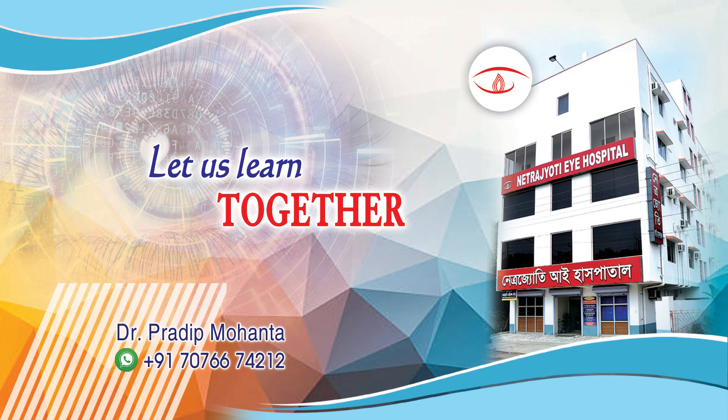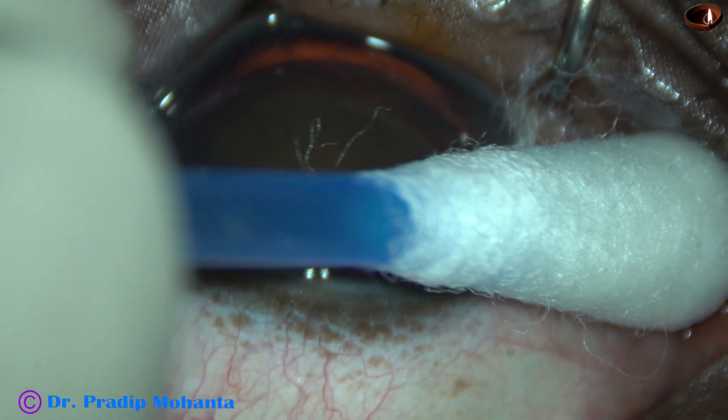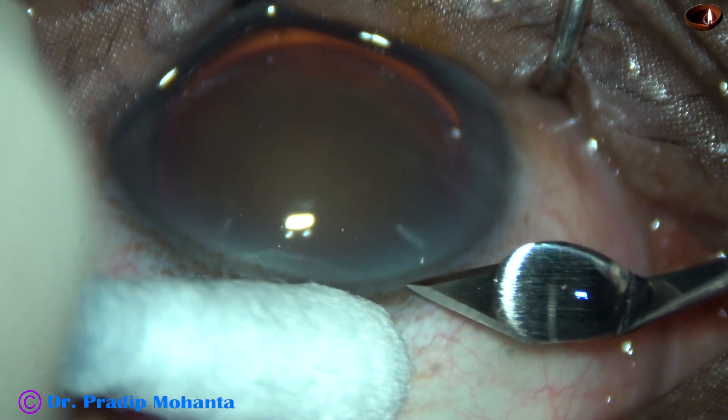Friends, welcome to my workplace at Ranakh Heart, West Bengal, India. This is a cataract with grade 4 nuclear sclerosis. The eye is deep-seated. Let us observe this surgery.